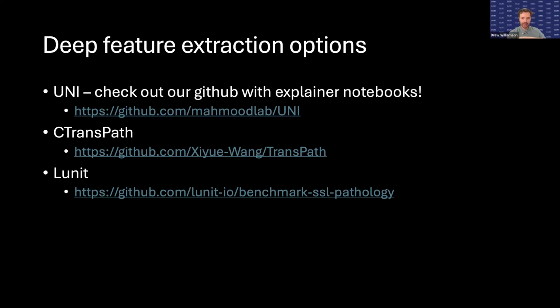It's pre-trained in a self-supervised manner. There's no labels or anything. And so I think you could make an argument that it doesn't really matter, but it makes people uncomfortable anyways. UNI does not use the TCGA images at all, only for testing some downstream tasks. But if you want to apply your model, so you're doing some molecular alteration prediction, and you want to use TCGA as a test set or a validation set or something like that, I would recommend not using CTransPath.